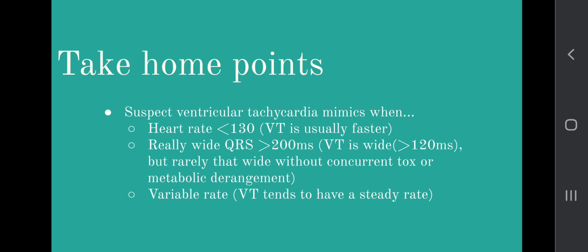And if you have a variable heart rate on the monitor, take a step back and think of your VTAC mimics. Ventricular tachycardia tends to have a steady rate and is clockwork regular.